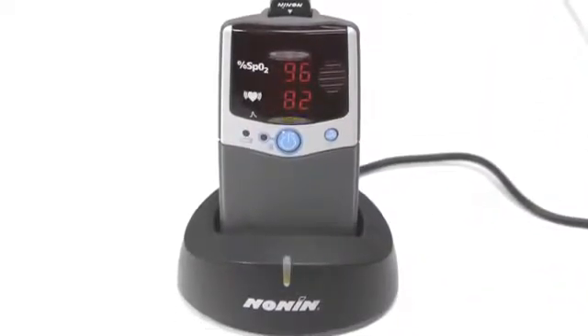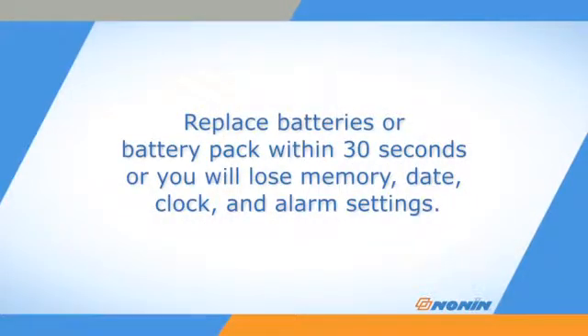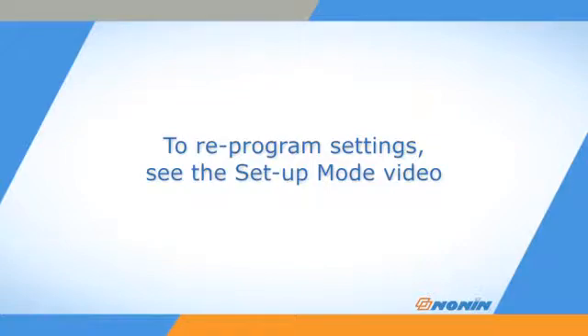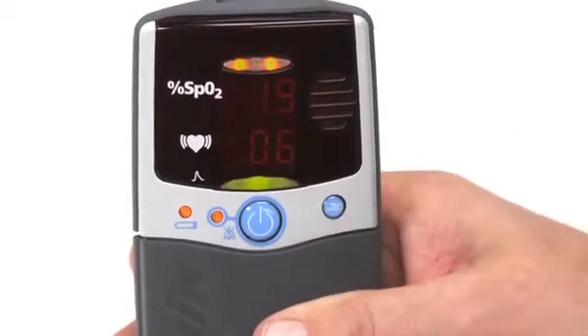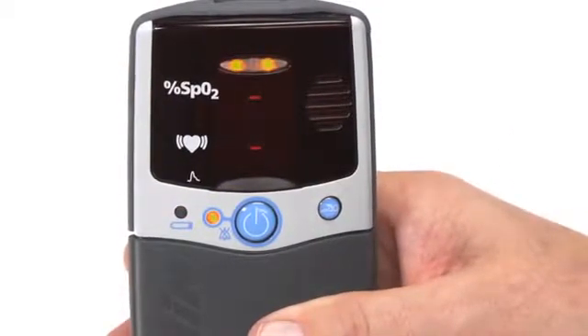Replace the batteries within 30 seconds to retain the clock, date, and alarm settings. It will also retain any stored patient monitoring data. These items may be lost if the unit does not have any power supply for over 30 seconds. If you lose the settings and stored data on the oximeter, you can reprogram the settings using the setup mode described in the 2500/2500A setup video. If the oximeter has had regular battery changes or recharges, the settings should be retained for its next use.